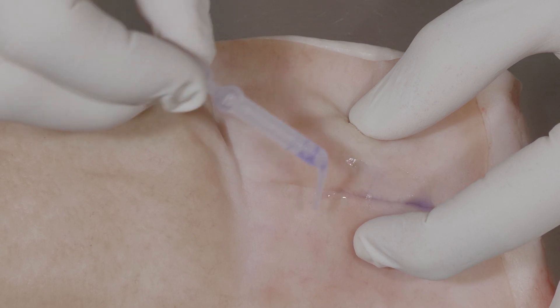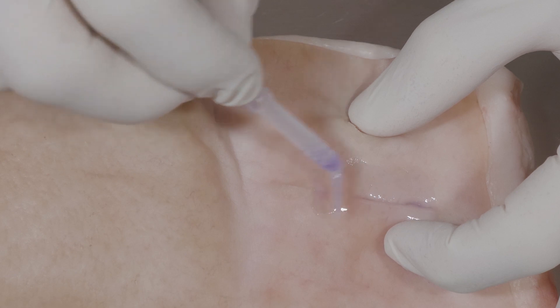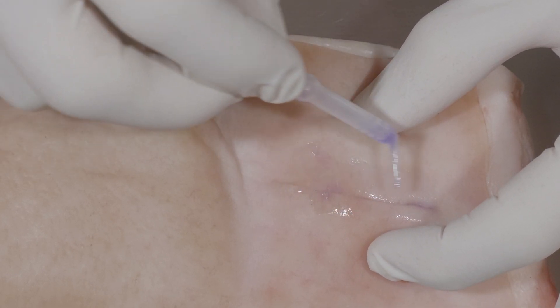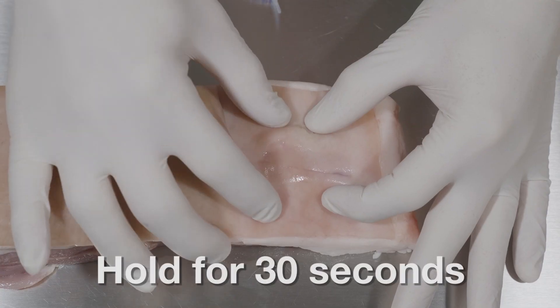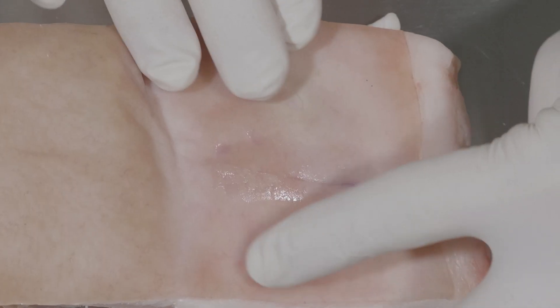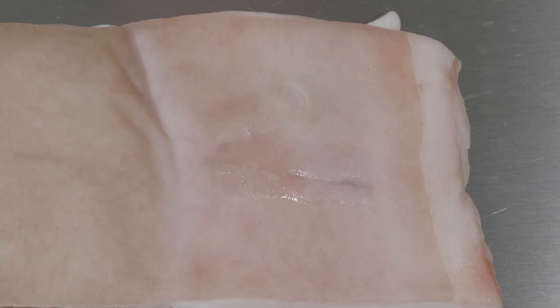Close one section of the wound first before moving on to another section. Glue Stitch will set in about 30 seconds when exposed to the air and when applied in a thin film. One layer is all that is required to effectively close the wound.